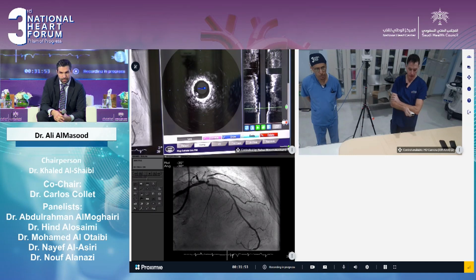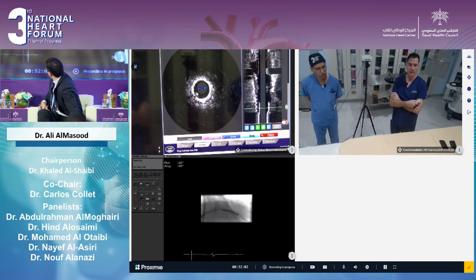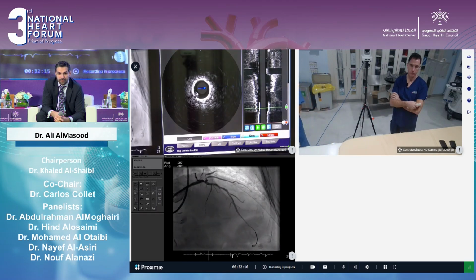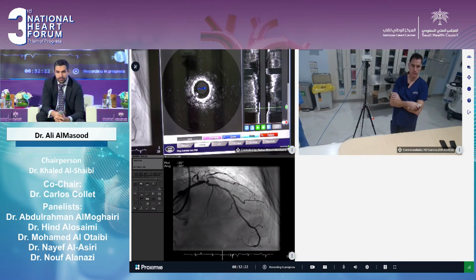And in terms of what we did, we did a stent boost with a balloon expanded in that area, which gives you an idea of the eccentric nature of the calcification. There's not as much wire bias as you might have, so the balloon did expand, and maybe we'll flip to the IVUS, and Ali will describe the IVUS findings. Yeah. So the procedure was completely guided by IVUS. We did it during the procedure and post-procedure.